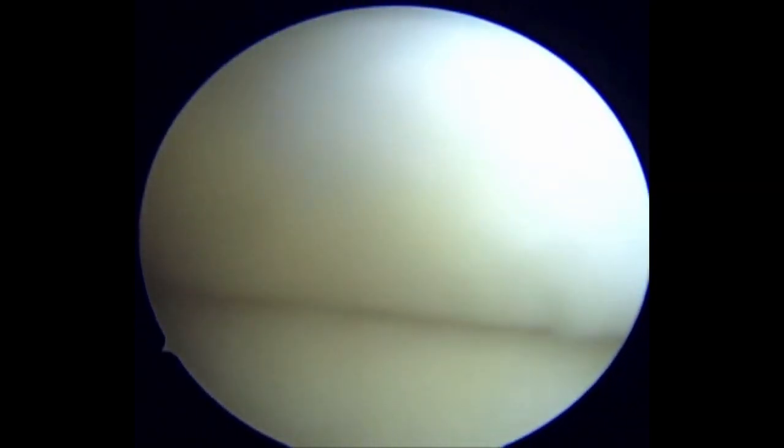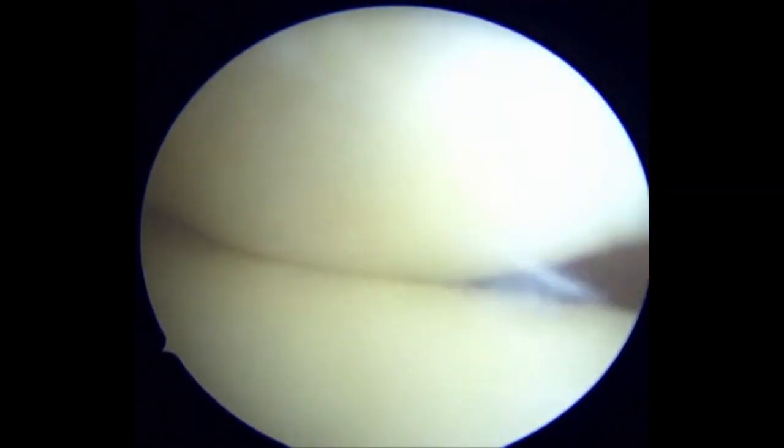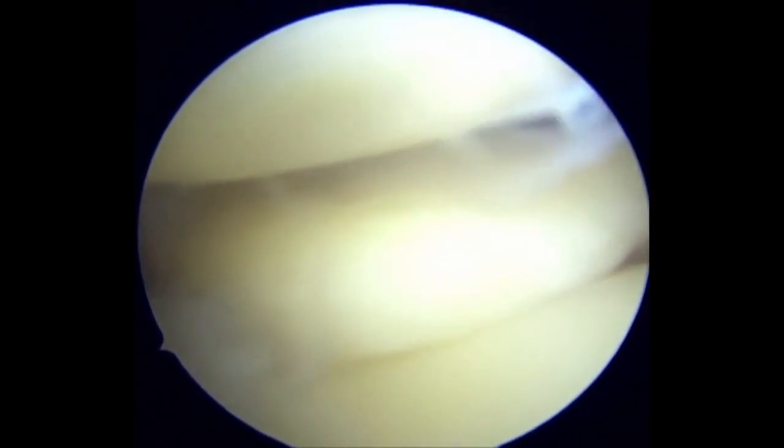A radial tear at the posterior horn junction of the lateral meniscus is noted. The instability of the flap influences our decision on the meniscus repair technique. We need to place additional stitches from the meniscus to the capsule to protect the radial repair and improve stabilization.